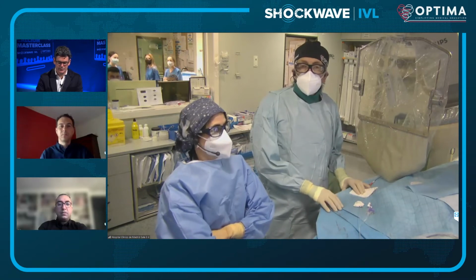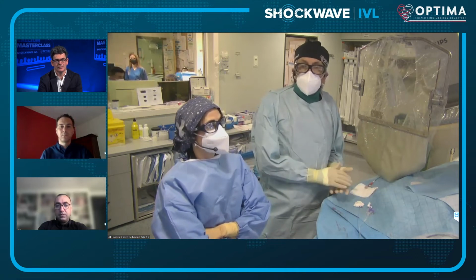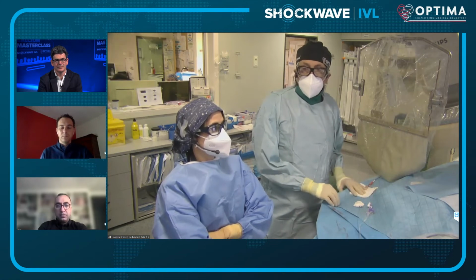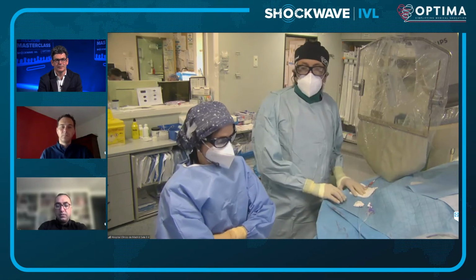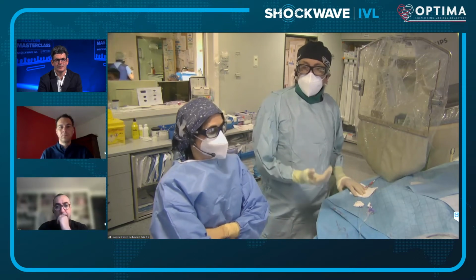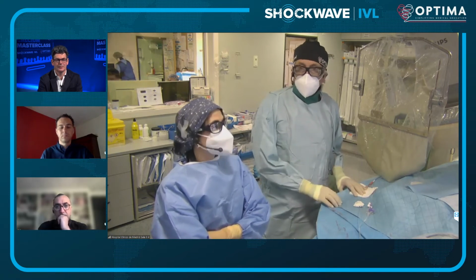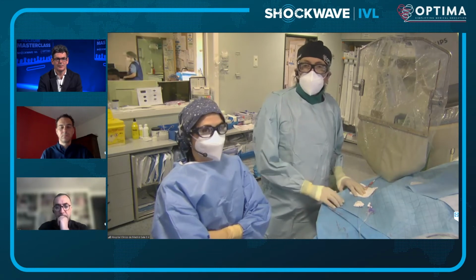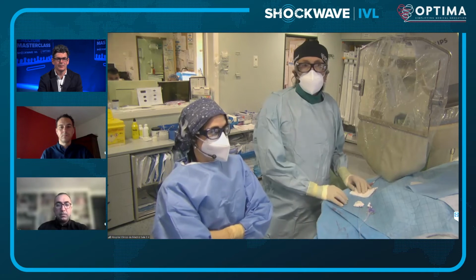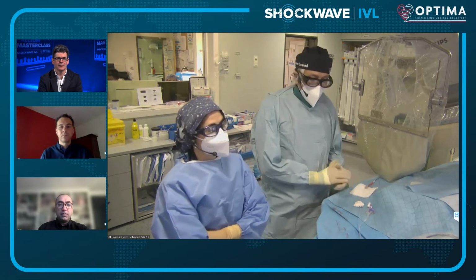circumflex and in the LAD, which in many occasions is desirable, because even if it is rare to have occlusion of a side branch when you are performing rotational atherectomy, for example, even then it's reassuring in many occasions that you have been able to wire successfully a difficult circumflex. You want to really have a wire in place and not have to wire the circumflex later after you have performed rotational atherectomy to the LAD. So these are some of the specific advantages that we see in the left main scenario.